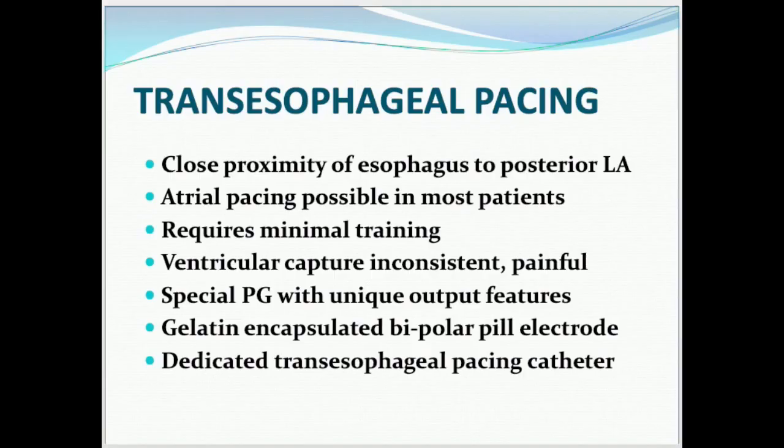Next, we have transesophageal pacing. The anatomical proximity of the esophagus to the posterior left atrium makes transesophageal atrial pacing possible in nearly all patients. This technique is relatively non-invasive and virtually free of serious complications. Furthermore, the technique requires minimal training to perform successfully.